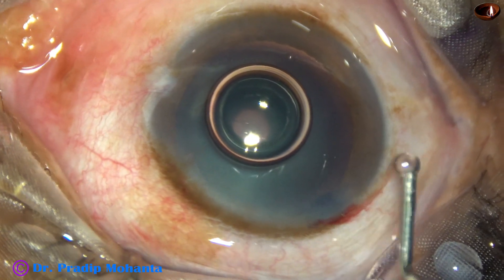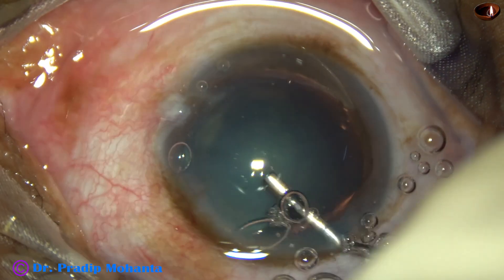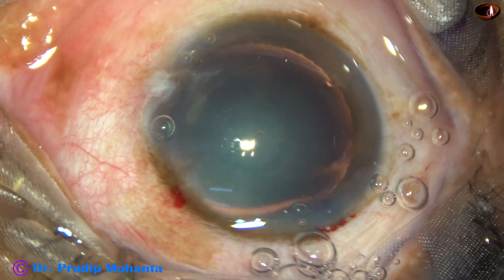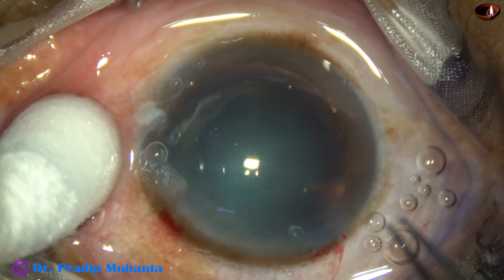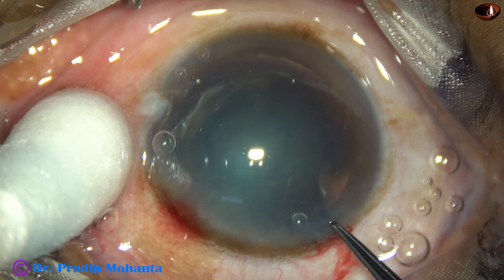The anterior chamber is filled up with 2% hydroxypropylmethylcellulose. And now for capsulorhexis, a Utrata forceps is taken.